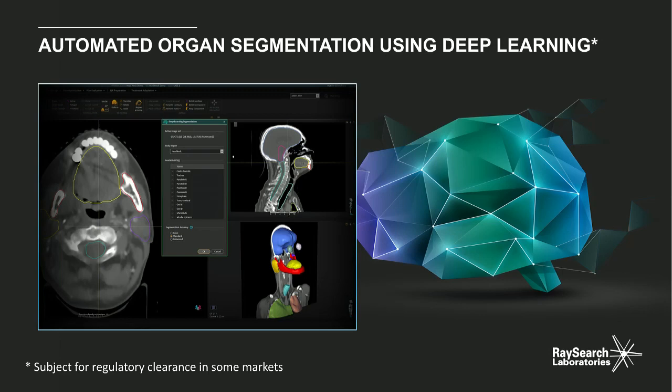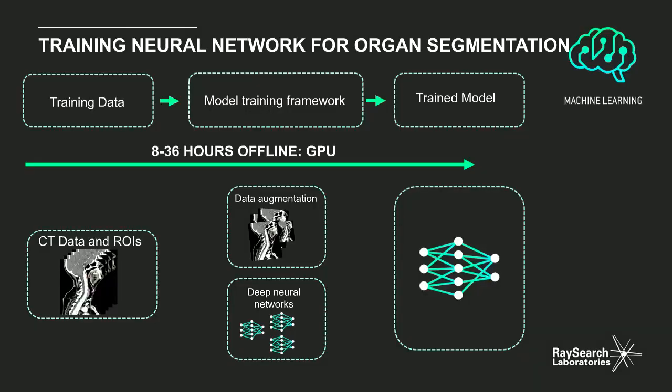In the deep learning techniques, we use a 3D U-Net convolutional neural network, and it's very useful for CT or medical images. In this application, we're also looking at target delineation, and we are not limited to CT. It can also be MR or other image formats.